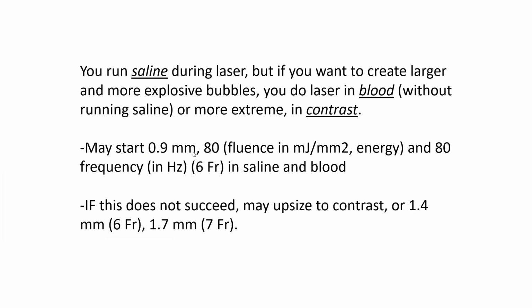So you may start with 0.9 millimeter, 80 and 80, frequency and fluence, in saline and then in blood. Then if this doesn't succeed, you may upsize to contrast or to a larger catheter, especially in larger vessels, 1.4 millimeter or 1.7 millimeters.